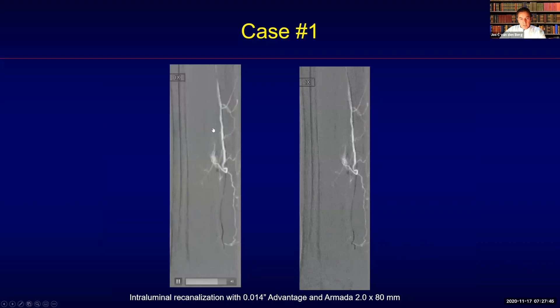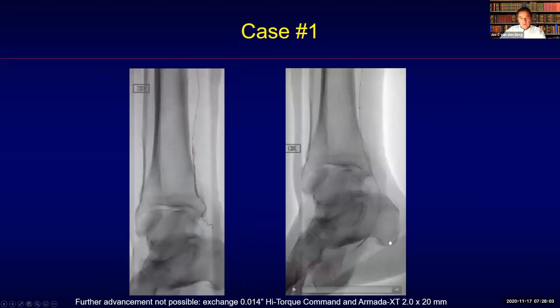Here you can see intraluminal recanalization with a 014 Advantage guidewire and an Armada 2x80 mm balloon that advanced up to a certain point, but it was not possible to go beyond that point because of the blunt tip of the balloon catheter.